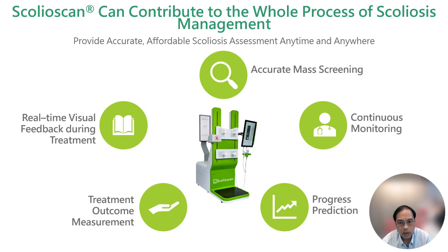Finally, the 3D ultrasound imaging system can contribute to the whole process of scoliosis management cycles, starting from accurate mass screening, continuous monitoring of progression, and even progression prediction using the 3D information of one scan or multiple scans. Treatment outcome measurement, as well as real-time visual feedback during non-surgical treatment, such as exercise-based treatment, so as to make sure that the internal structure is as we expect during the exercises.